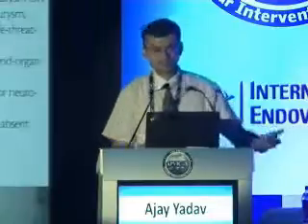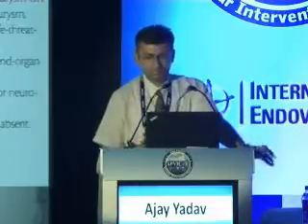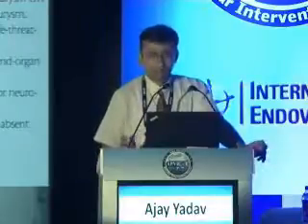Then, of course, the future is going on to PEVAR, which is the gold standard now, I think, for all aneurysms which can be tackled. If you have a favorable anatomy, I would definitely go in for PEVAR today. A lot of access site complications, we all know it. There are a lot of angiograms which need to be done, a lot of amputations, or I would say gangrenous changes that could have been avoided had somebody taken care of these access site problems.